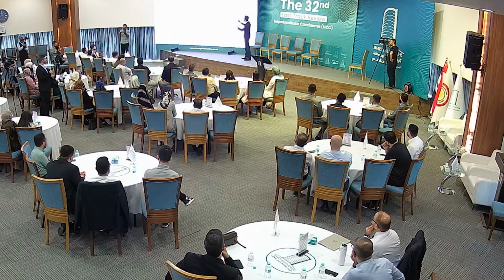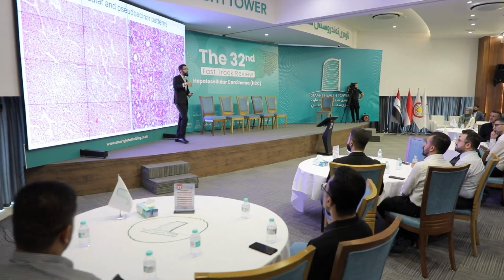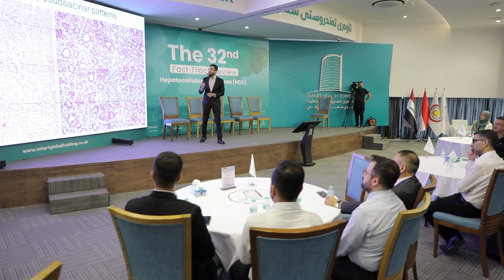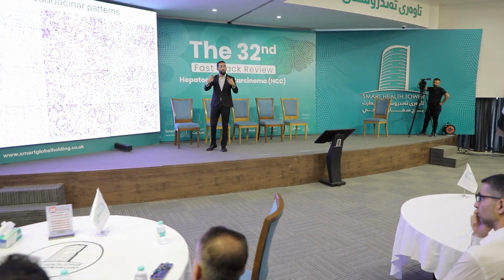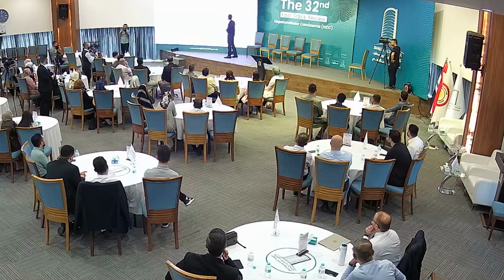Now, it's not only in this form of solid trabeculae. Sometimes you can have gland-like structures inside a hepatocellular carcinoma. This can cause confusion with a cholangiocarcinoma. But the difference is that these are actually not glands. These are just dilated bile canaliculi within the tumor. They contain bile, and we can use some other features to distinguish them.